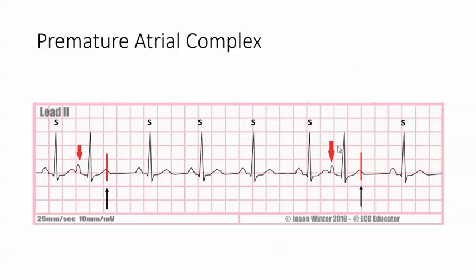The way I confirmed that is by taking the distance from this R wave to this R wave. You can use calipers and then place them here, because this is the wave. The next beat should have appeared here — so you can see it's a premature beat with an odd-looking P wave.